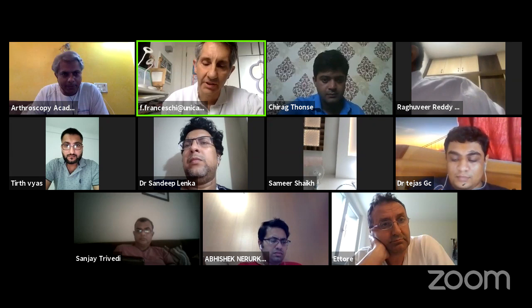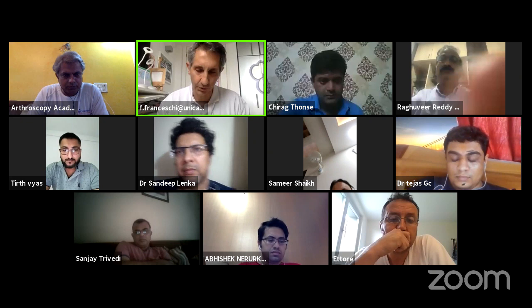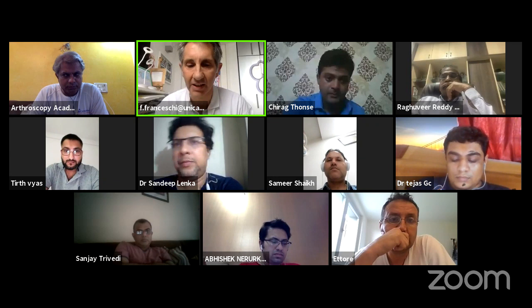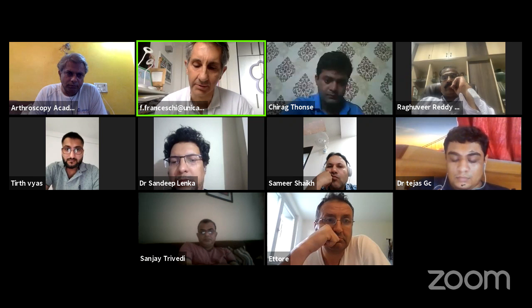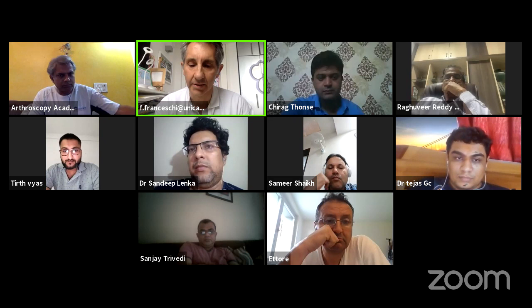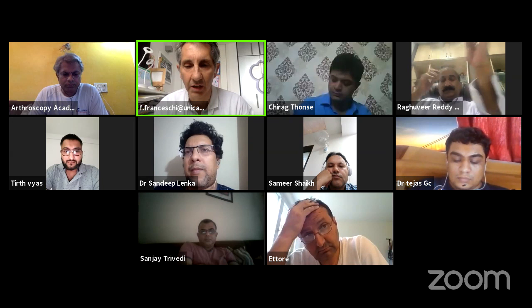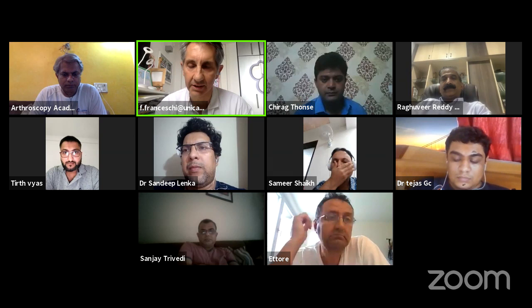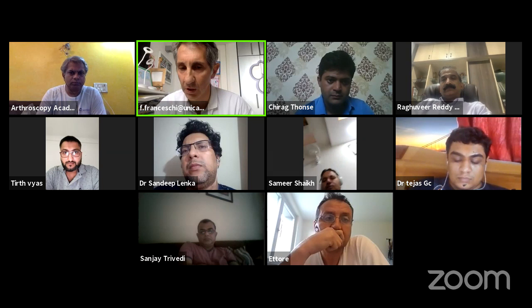As I showed you before in my presentation, I don't use the ISIS score because it's too invasive for me. I am really a believer of arthroscopic surgery, and I used to perform this kind of surgery most of the time. Maybe that was the reason, because I started with my arthroscopic Latarjet experience. My personal algorithm of treatment is to use only Bankart repair when you don't have a Hill-Sachs lesion at first. But most of the time, when I have to deal with a bipolar defect, so with a minimal glenoid defect, of course, not a bigger glenoid defect, and a Hill-Sachs, I'm very happy to perform both procedures contemporarily, Bankart repair and remplissage repair.